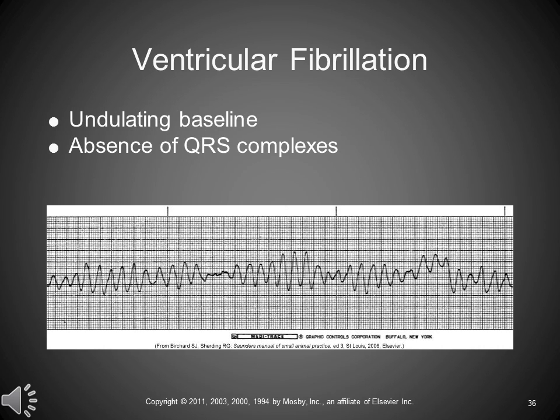And as you would imagine, they can't pump blood. Okay, this is an acute, life-threatening event on an ECG. You're on the way to dying, and you're probably going to die anyway. You see VFib, you start treating with one hand, but you're yelling to the kennel person to get a bag with the other.